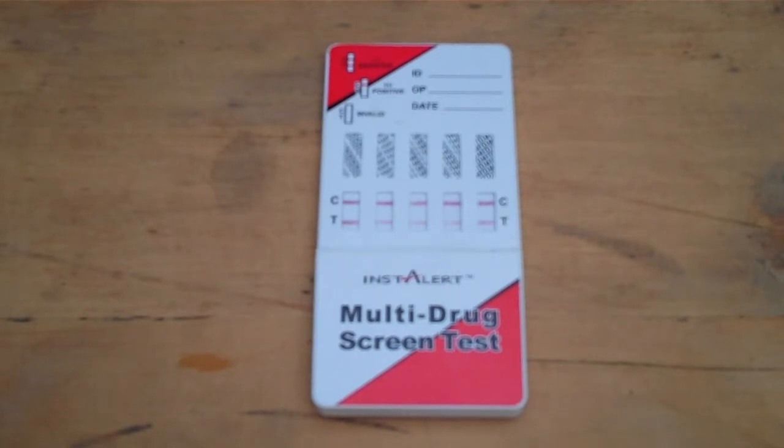that your positive result was not down to illicit drugs but may be down to substances like cocodamol or other codeine-based products that may give you a positive on the opiate test. Unfortunately, with these types of tests, you have no ability to determine whether a positive opiate test is down to cocodamols, DF118s, i.e. prescribed, legal or over-the-counter codeine and opiate-based analgesic products. You cannot differentiate those on a simple dip test from street heroin or opiate use without proceeding to a GCMS.